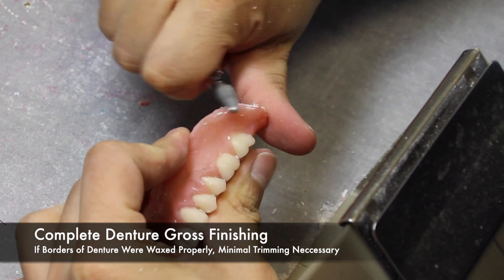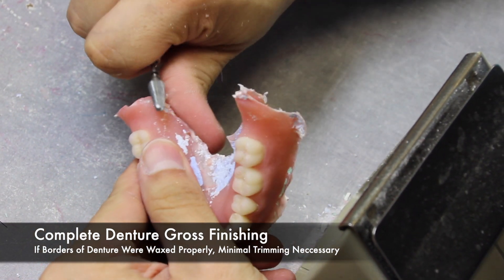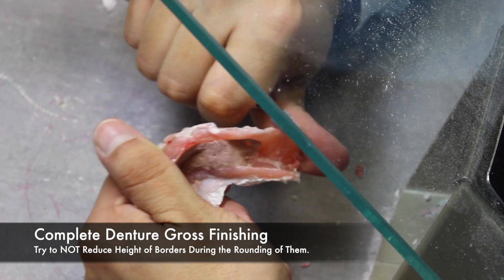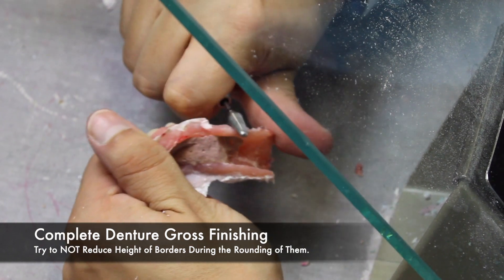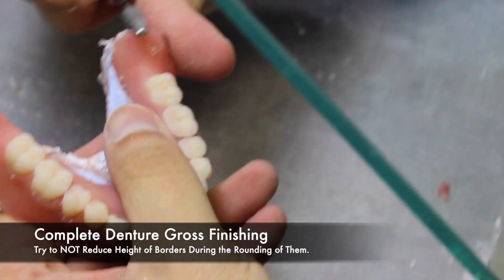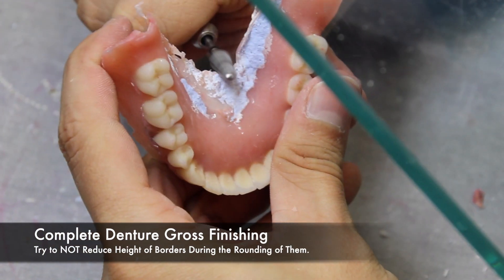The trimming should be minimal. To check if the borders are sharp, run your finger along your denture borders. If they are sharp to your finger, chances are they will feel sharp intraorally to the patient. Take caution in performing these steps. If the denture border is reduced too much, it can affect the retention intraorally.